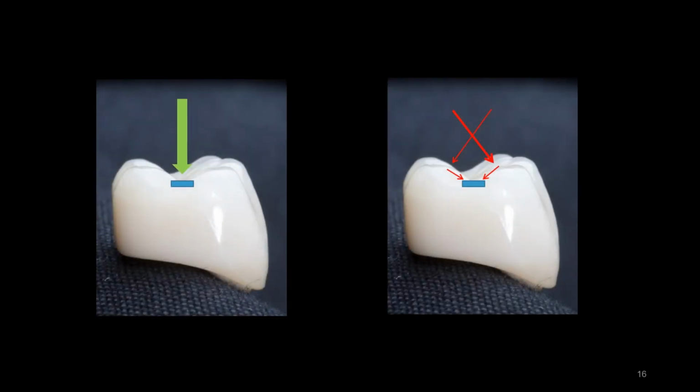The other thing that I've noticed in certainly my journey is that the mother of all problems has been the hit and slide. You have to remember, patients cannot feel their denture teeth. There's no nerve to the tooth like there is on a natural tooth. So when you ask a denture patient to close or touch or bite and their teeth come together, Mark, you dummy, they can't feel their teeth touch. There's no nerve there. There's no feeling there. So they can't feel a hit and slide. And a hit and slide is where it hits the guiding plate and slides into position.